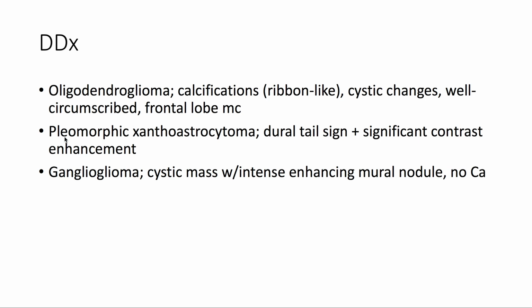We also have pleomorphic xanthoastrocytoma, which can demonstrate a dural tail sign and significant contrast enhancement, and ganglioglioma, which will show a cystic mass with an intensely enhancing mural nodule within, and no calcifications.